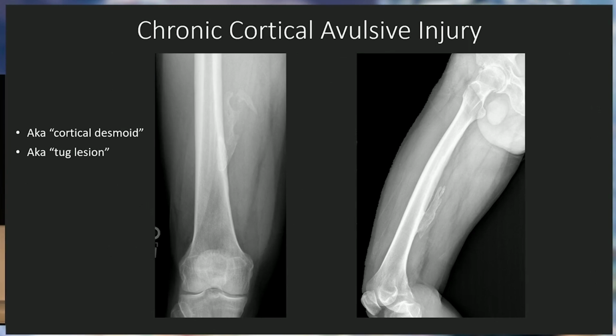If this bone lesion in an adult or a young patient doesn't fit, it's a pretty good explanation. So it's important to understand where the weakest link is and how to process these things, so we can make it fit the patient rather than taking something that doesn't fit and calling it pathologic. You have to know all of the background, the T1, the T2, the theories, and put all that together to figure out what this probably is.